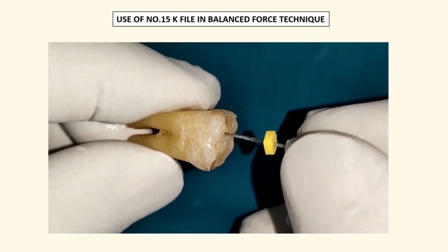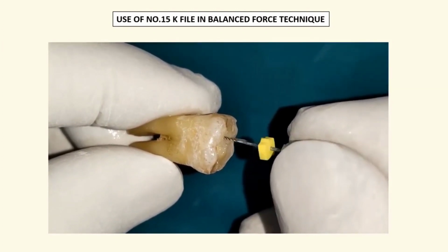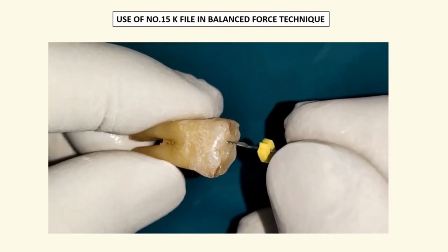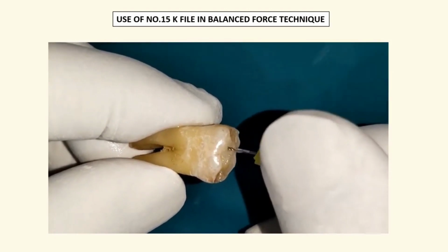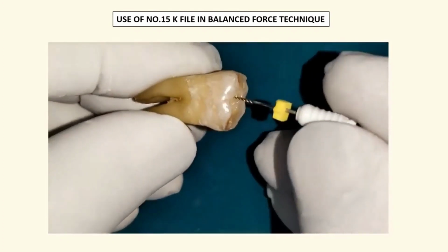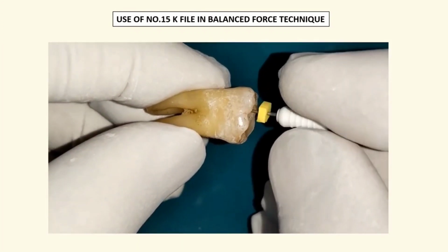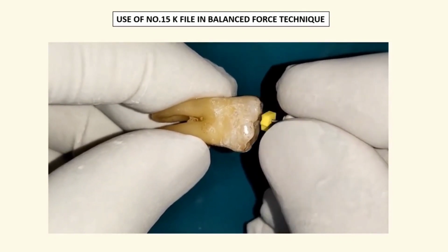This is a small video showing the use of the number 15K file in a balanced force technique. The 15K file coated with EDTA gel is passively inserted into the canal. 90° clockwise, 270° anti-clockwise. 90° clockwise, 270° anti-clockwise. Repeat this motion 1 to 3 times. And a 360° full clockwise turn, and remove the file.